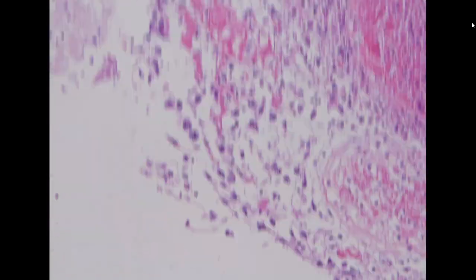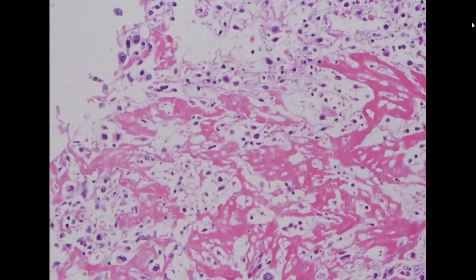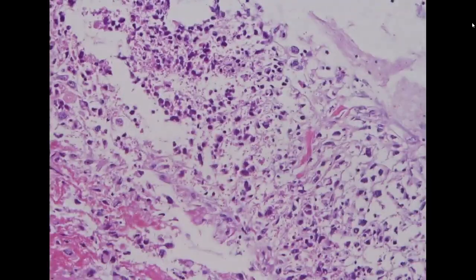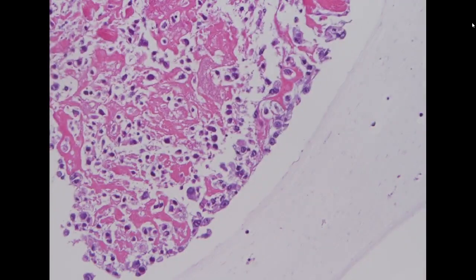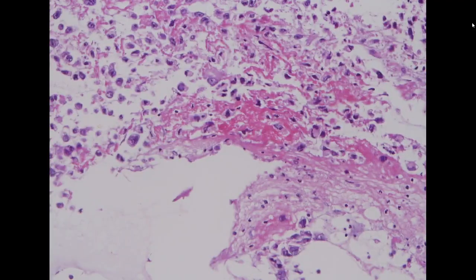And we have a surgical biopsy specimen, and the pathology already did tons of immunostains on the specimen. It doesn't show any epithelial marker, it doesn't show any lineage-specific marker like TTF1, so it ended up as undifferentiated sarcoma. So I think this is probably the same disease, but just a little bit more epithelioid here than spindling. So we call this positive for malignancy.